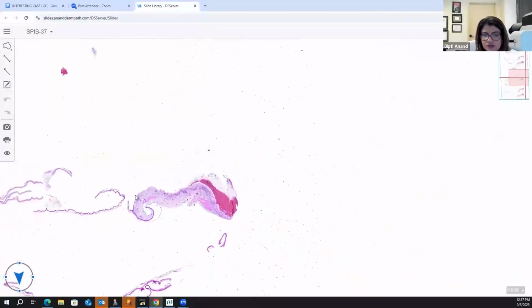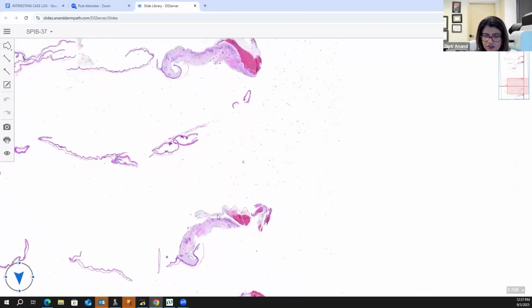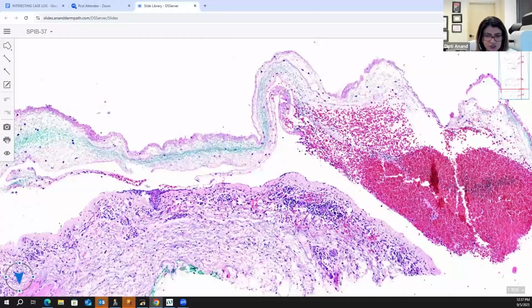Yes. So you have a cell-rich subepidermal blister. This is like a little upside down. The epidermis has fallen off over here. But again, this kind of fibrinous, degenerated, fluid-like stuff in the blister cavity with eosinophils at the base is pretty classic for BP. Last time when I was teaching you blistering disease, I did teach you guys that this is the kind of fluid you see in bullous lupus, linear IgA, and in BP within the blister cavity. So this is pretty classic for BP. Any questions? Good.